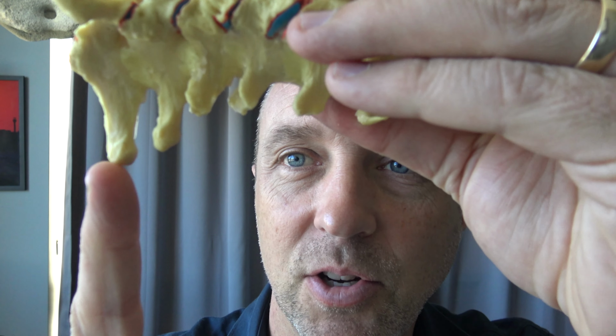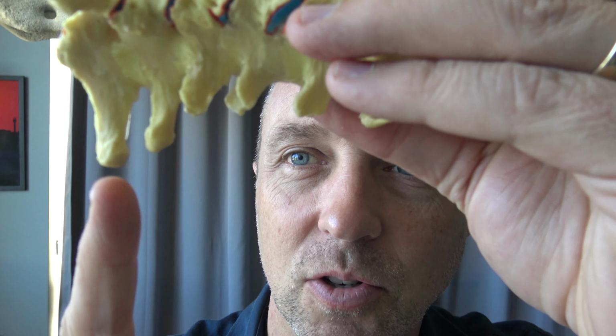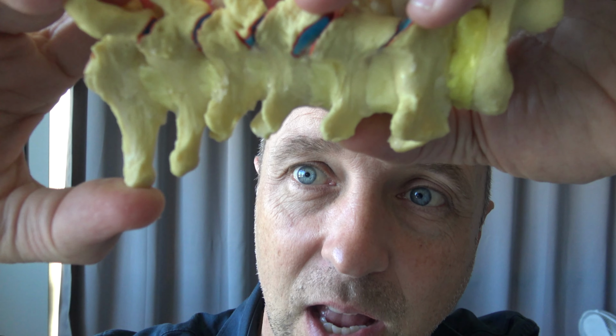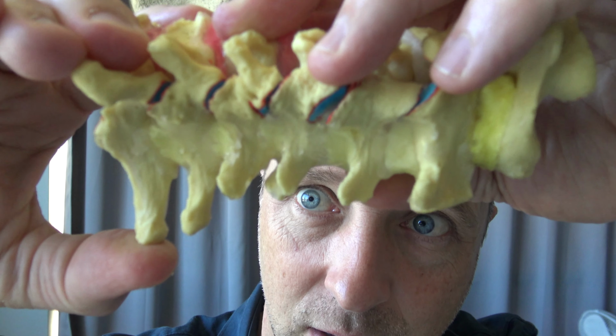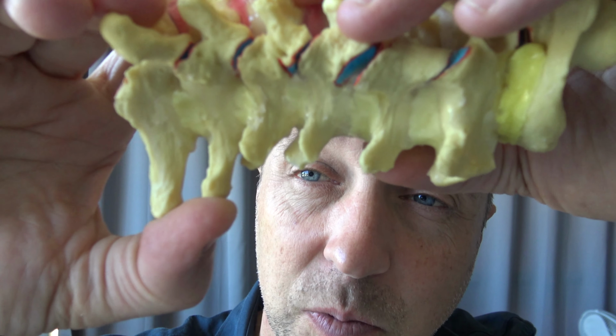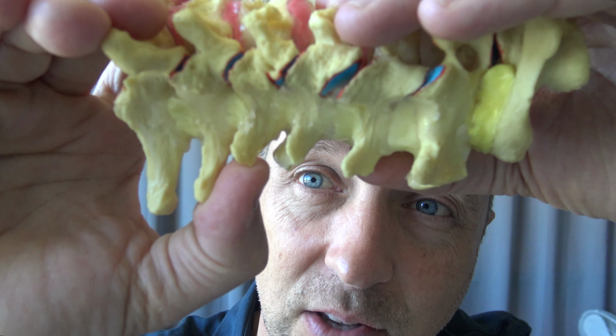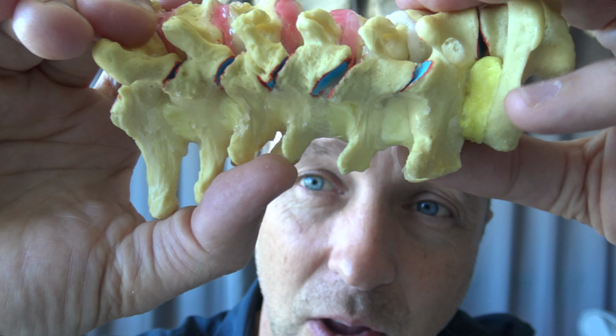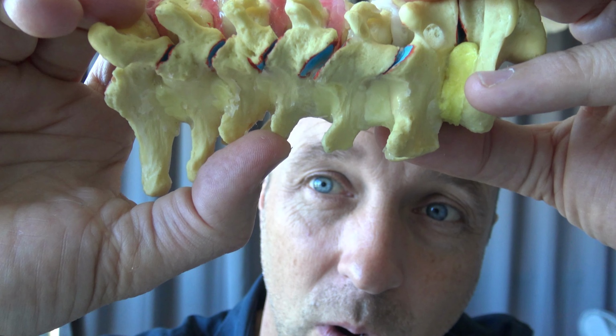So they're lying supine, and I push posterior to anterior on anatomical structures. I push on the spinous process, and I'm watching the gauge. Is that sore? No, it's not. Is that sore? No. And I'm using specific force right on the spinous process. All of a sudden, the meter starts to come up just a little bit. The meter comes up even more.